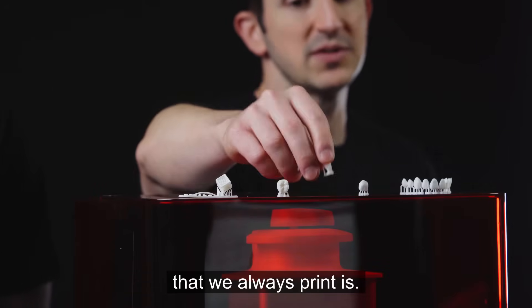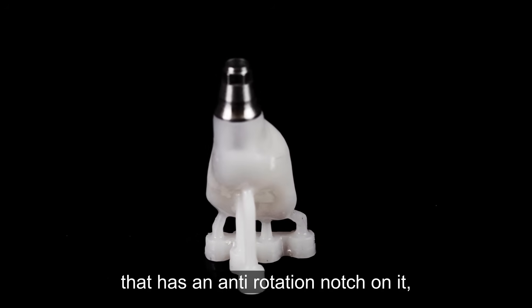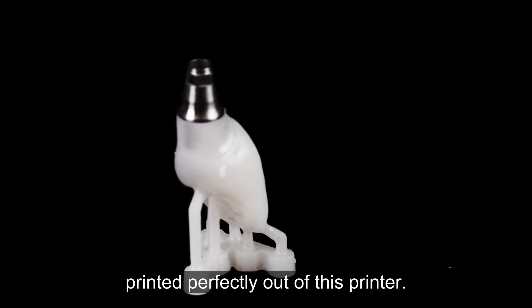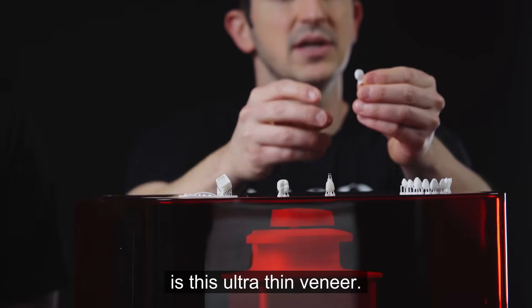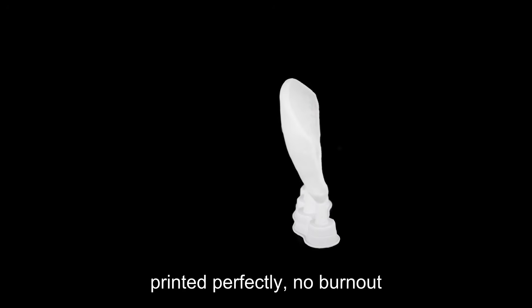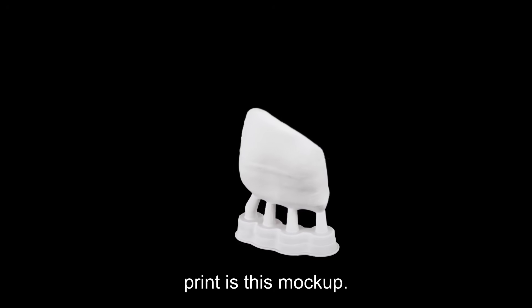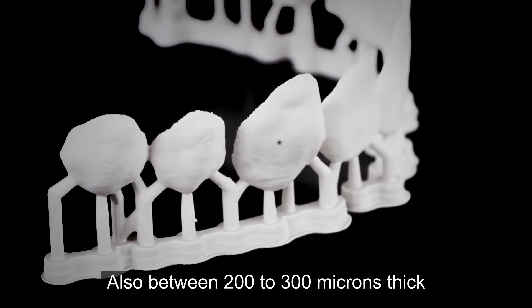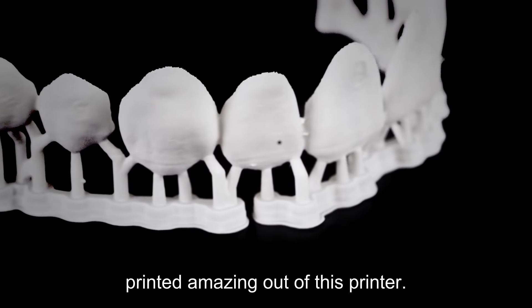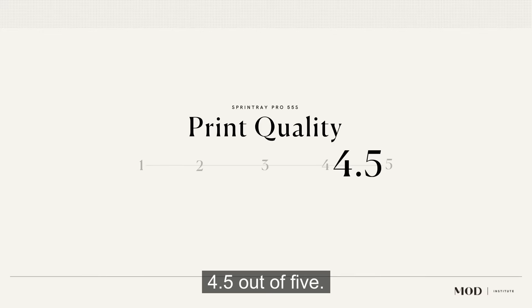The next benchmark is this tie base crown — a true abutment tie base with an anti-rotation notch on it, printed perfectly out of this printer with amazing fit. The next benchmark is this ultra thin veneer, about 200 microns thick, printed perfectly with no burnout at the margin and amazing detail. The final benchmark is this mock-up: 10 units of a smile try-in, also between 200 to 300 microns thick, printed amazingly out of this printer with the Sprintray ceramic crown. Overall, for print quality, we rank this printer 4.5 out of 5.